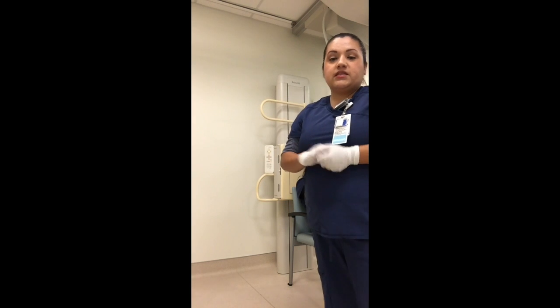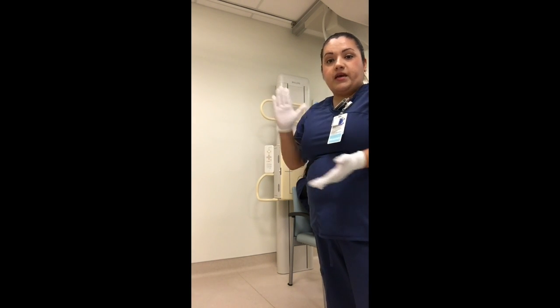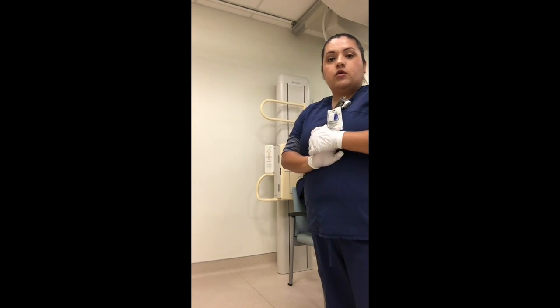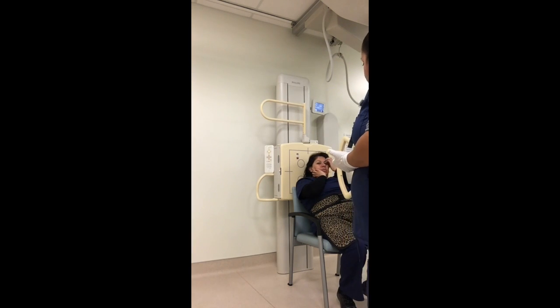Beep. Okay, so this last projection is going to be the SMV projection, also known as the Schüller method. So I have my tube detented to 40 inches. I have my patient shielded, and I am going to collimate to 10 by 12 lengthwise.